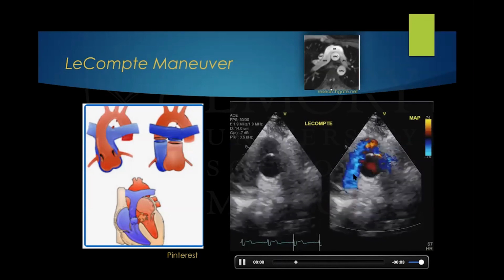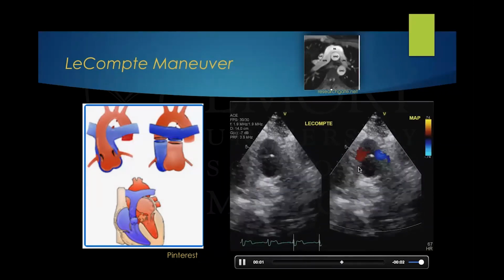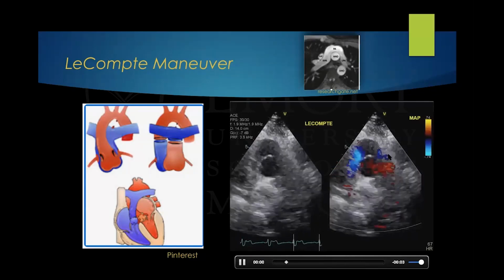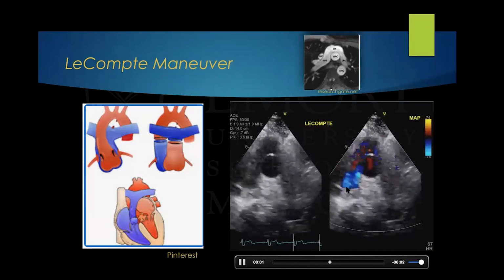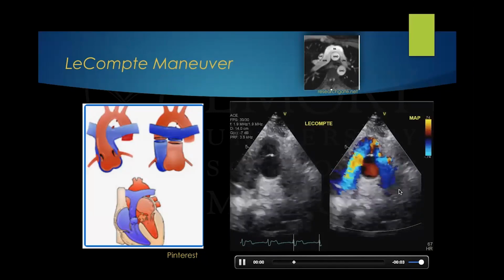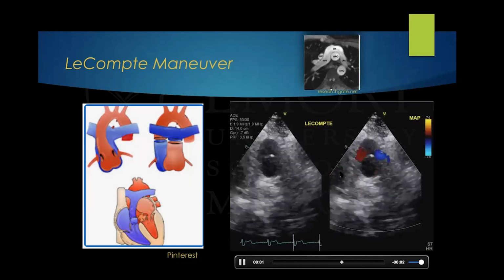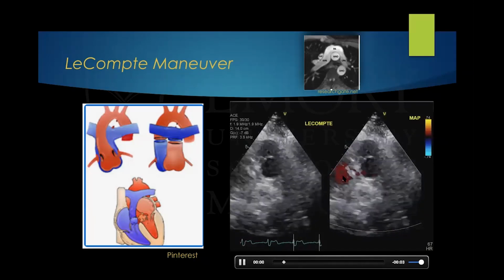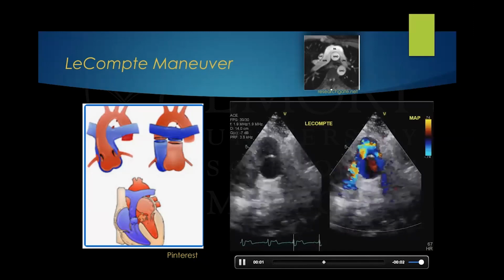The only caveat with this is that these branches can get stenosed and compressed sometimes by the aorta or by the surrounding tissue. So we have to be very careful that we address both right and left pulmonary branches. So again, this is a high suprasternal notch or suprasternal view, and we're aiming to the pulmonary arteries.